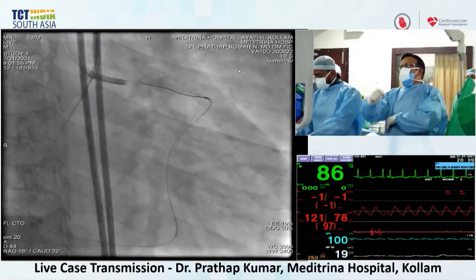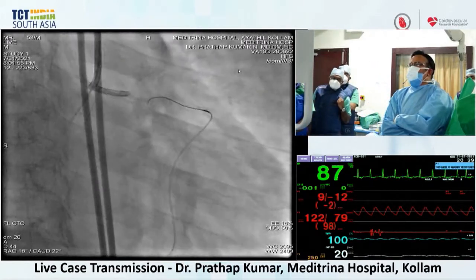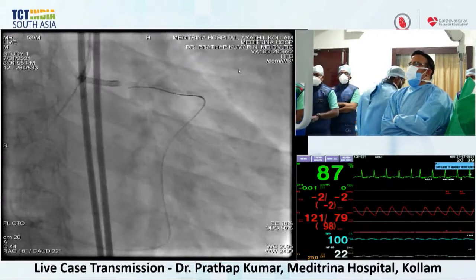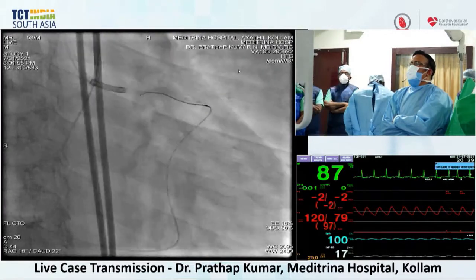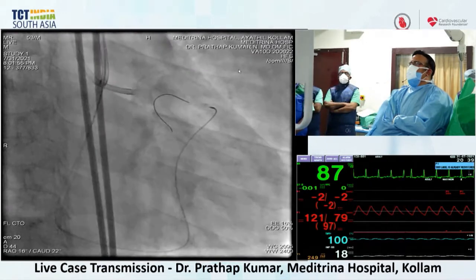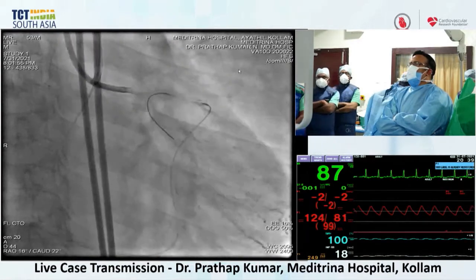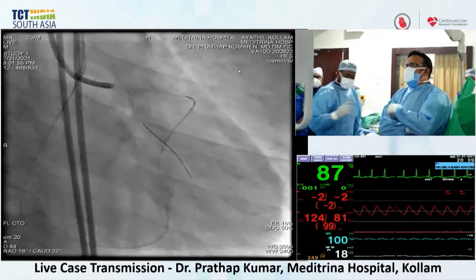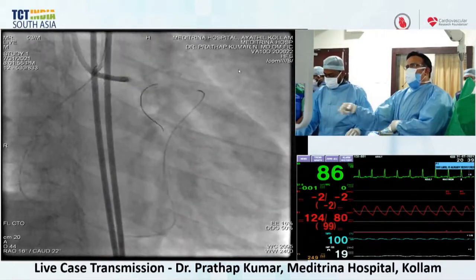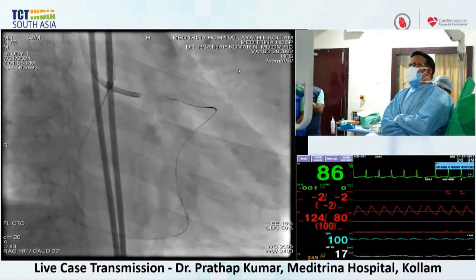This was the position we left. Actually, the wire is going inside. Can you see? Yep, we can see it. Okay. We were discussing the strategy that was used when the audio went out. No, this is actually the next one, I think. This is the wire which actually went inside, and we just kept the microcatheter as possible. I think next, we cross. Next.